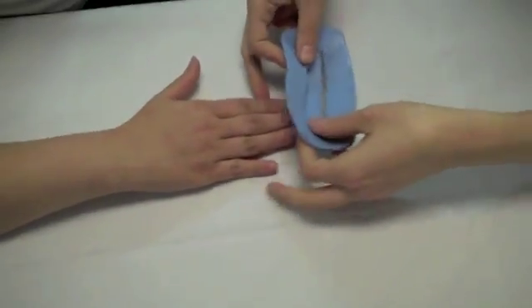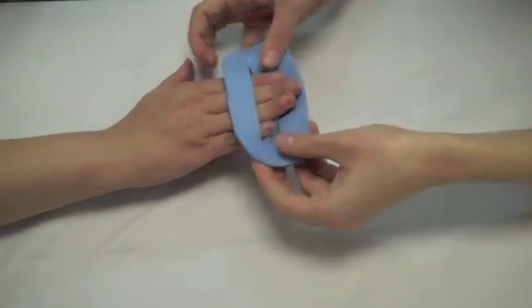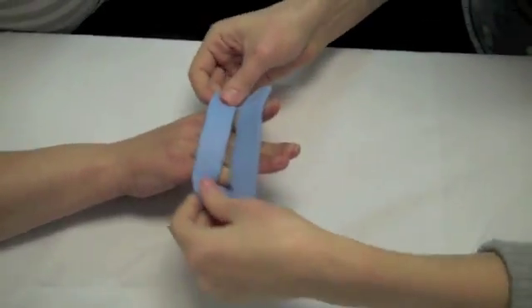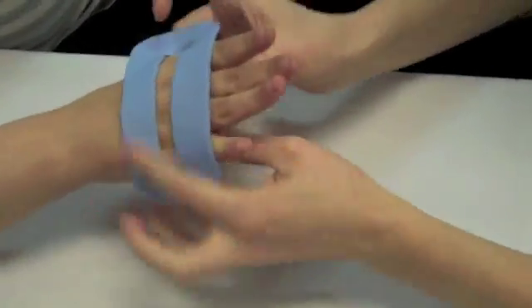Slide the proximal end of the splint over the patient's fingers so that it rests on the dorsal metacarpal surface. The distal end of the splint should rest across the dorsal surface of the proximal phalanges.